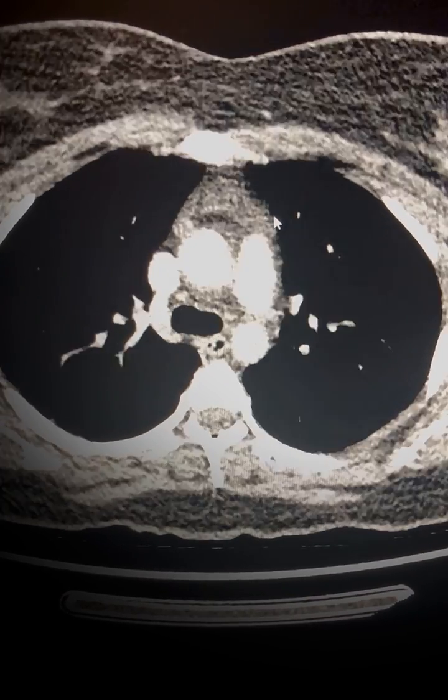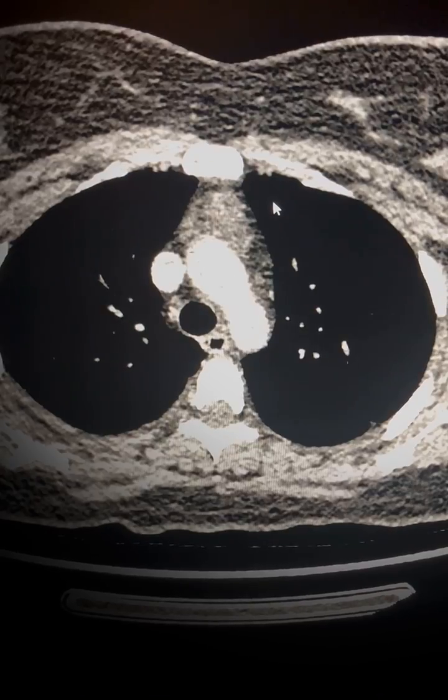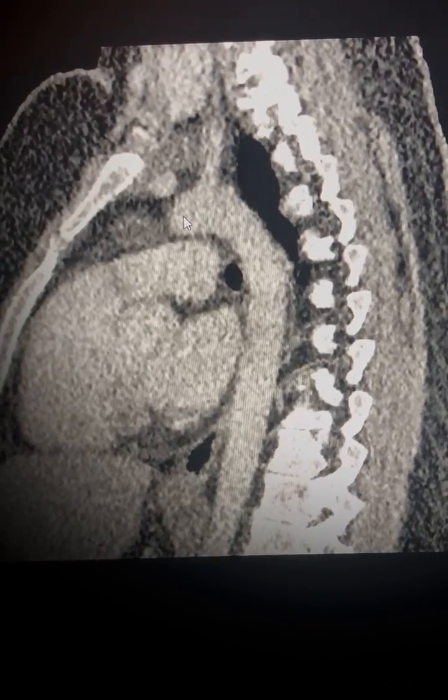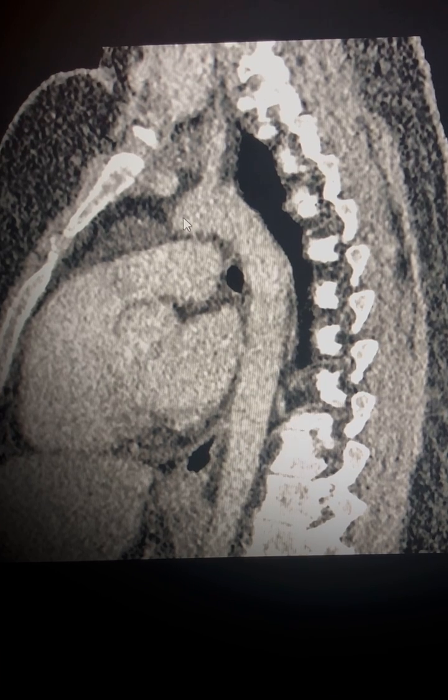To further highlight this, we can also show other planes of this area where you can see a rather triangular-like appearance without a distinct mass occupying the thymic region, again favouring thymic hyperplasia. Thank you.